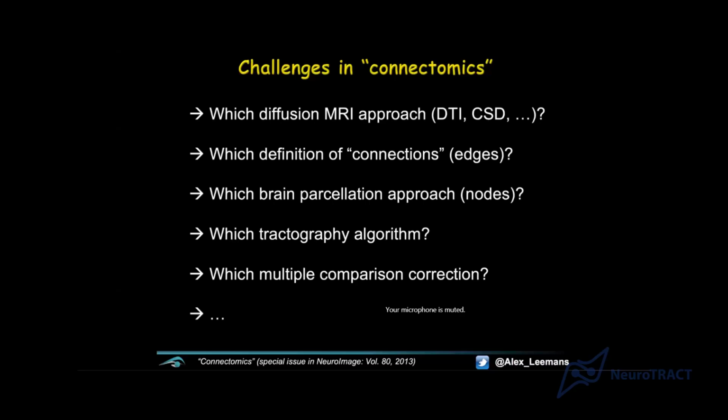And there are many more, like which tractography implementation and the settings. What about the statistics? If you're doing a multiple comparison or multiple subjects analysis, you would be looking at which node is important. Well, obviously we've got many nodes, and by chance there will be one that is significantly different. But because we're looking at so many comparisons, you need to correct for that.